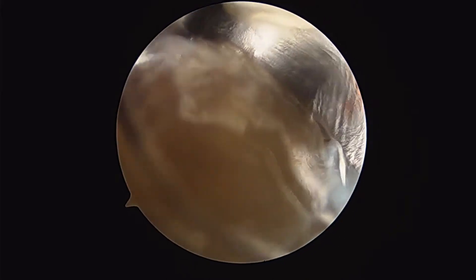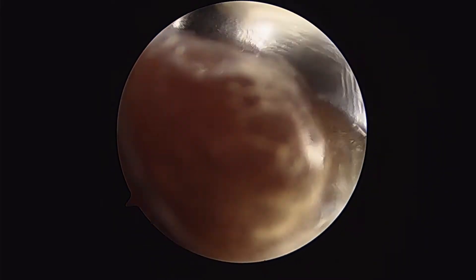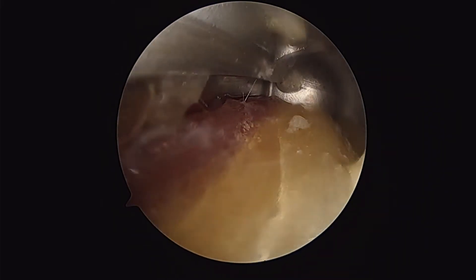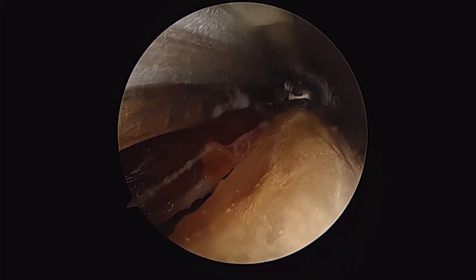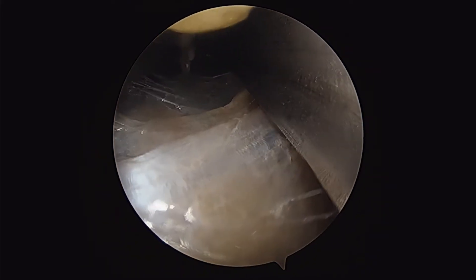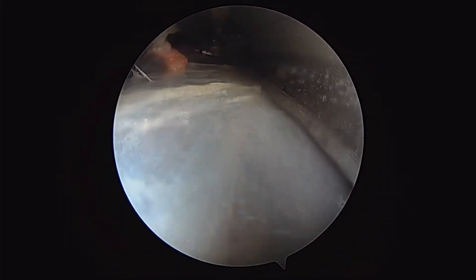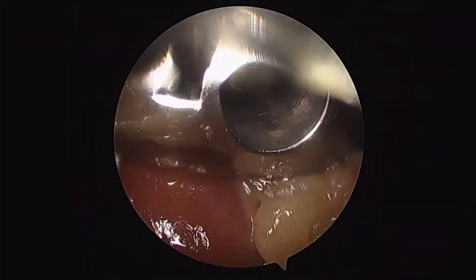I'll start initially at the distal incision and work down towards the ankle. Then I'll reverse the guide and work proximal. Then I'll make a secondary proximal incision. Advancing the guide distally, I'm able to connect the distal fasciotomy to the proximal fasciotomy. And then reversing the guide once more, I'll work proximal towards the knee and complete the proximal limb of my fasciotomy.